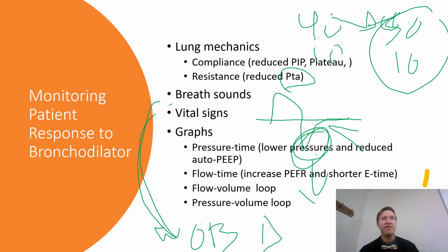I got my patient on non-invasive ventilation. Well, what if they're breathing really fast on non-invasive ventilation? Will an MDI really help me, right? Will I be able to have adequate technique and to time that breath with that patient on non-invasive? No. So that patient might be more appropriate for a proximal nebulizer in non-invasive, right? So you've got to know your advantages and your disadvantages. Like I said, more dynamic than just your spontaneous breathing patient. But hopefully you have a little bit more clarity here. You can go back through this and sort of see from there.